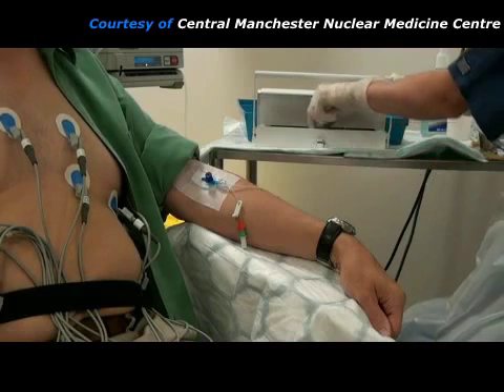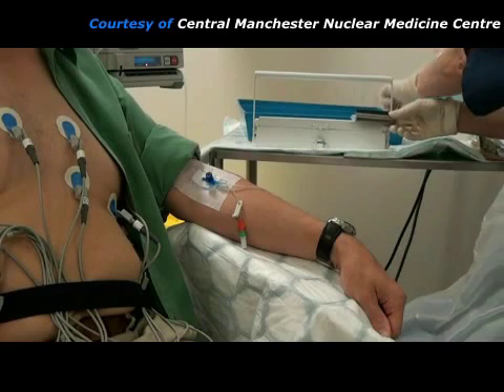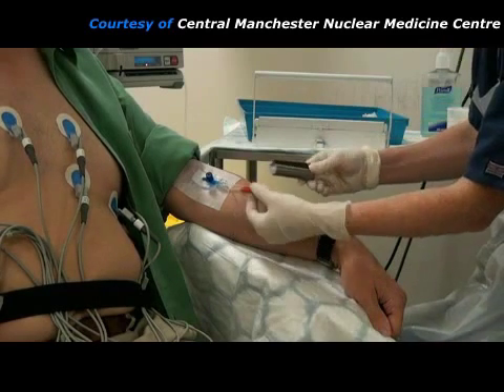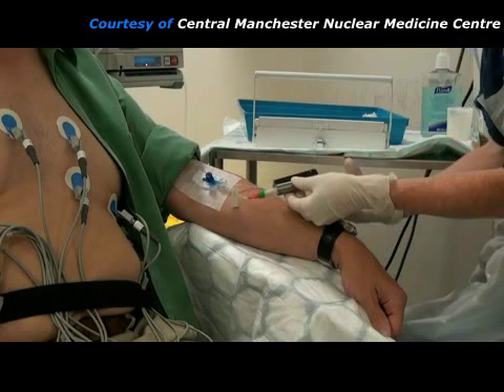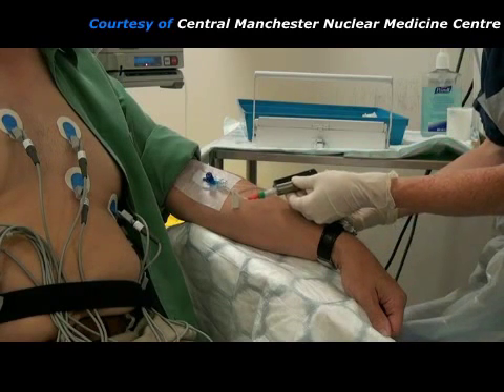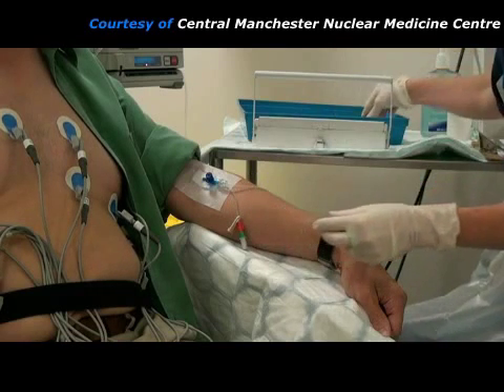The radiopharmaceutical is kept in a lead-lined box and the syringe is shielded with lead to protect the practitioner's fingers from the radiation. When the maximum heart rate has been reached, the radiopharmaceutical is injected through the same needle, and then the stressing is continued for a further 2 minutes.